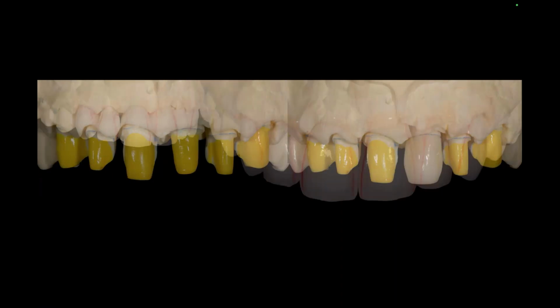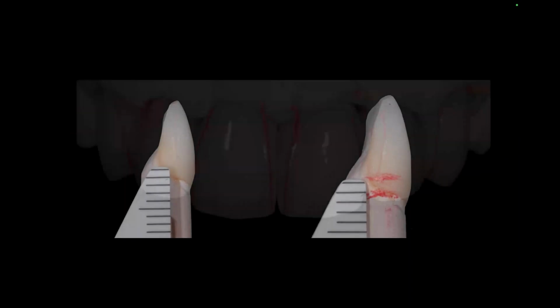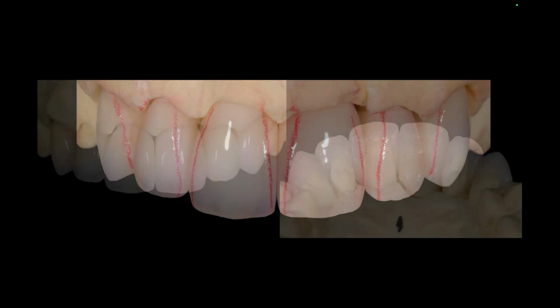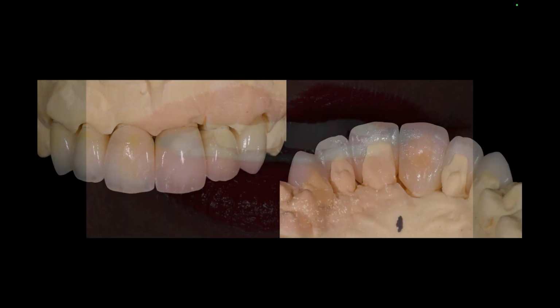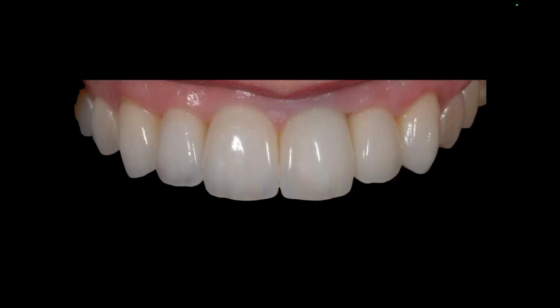And then I went and did my normal buildup and all the things that I did, put my marginal finish line a millimeter to the contact, all the normal stuff that you would normally do because this patient would have had black triangles otherwise. So in the end, you can see this is a full coverage crown, and it looks pretty bright here next to the other teeth. But when we go to put that in the mouth, it actually is going to work out fairly well. Is it perfect? No, I can see that grayish hue for sure. And again, this is 10, 15 years ago. You can see the grayish color up by the tissue.